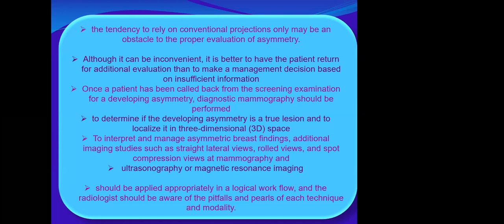Once a patient has been called back from the screening examination for developing asymmetry, diagnostic mammography should be performed to determine if the developing asymmetry is a true lesion and to localize it in three-dimensional space, even for the focal asymmetry.